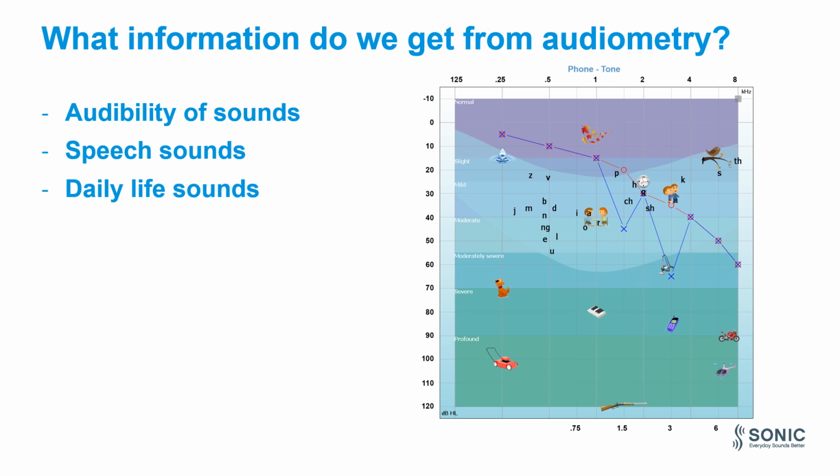Basically, after doing pure tone audiometry or PTA for those who are not familiar, which is another word for a hearing test, we are able to know whether one's hearing level is very good or very bad. In fact, did you know that the audiometry test is actually more than 100 years old now, and for good reason? That's because it's the most basic, but most important test we do in the field of audiology.